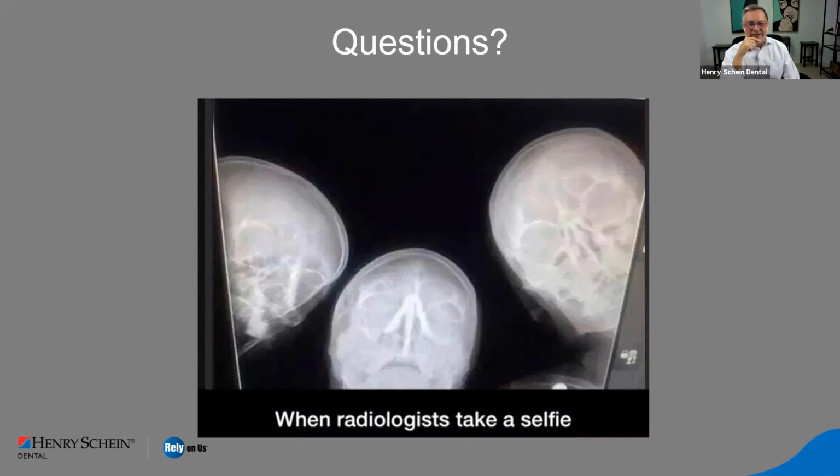Okay, one more. Are there any special considerations for patients that have a missing lateral upper with history of cleft palate and lip? Well, certainly I would want to review the CBCT. We know that they usually have a very atrophic alveolar ridge.